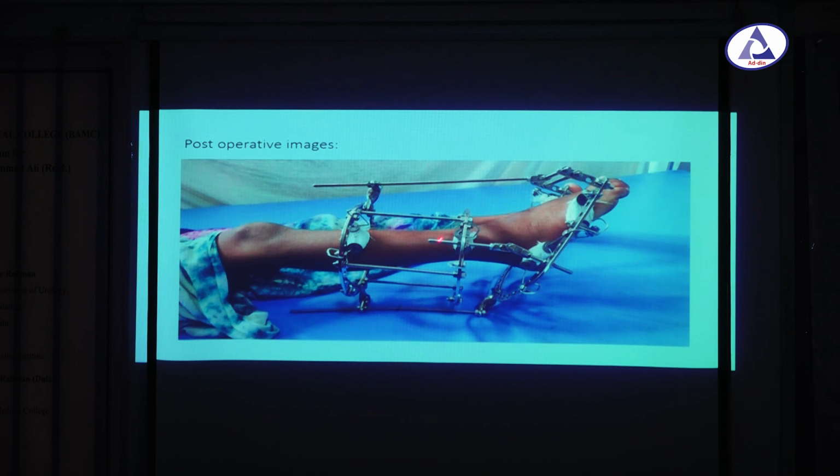And these two rings are in the leg portion, and one U ring is in the foot, and there is a hinge here. Okay, and this technique is very simple. We applied a rod here and another rod here. The simple thing is gradually we shorten this rod and gradually we increase the length of this rod. So subsequently the foot deformity is gradually corrected, the equinus foot is gradually corrected into its normal plantigrade position.